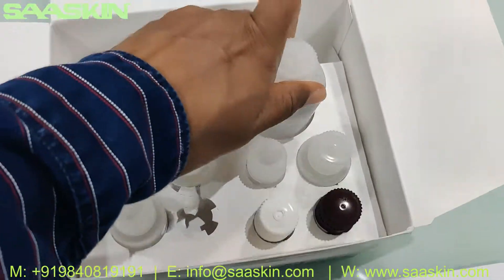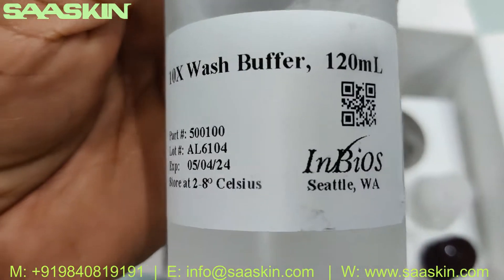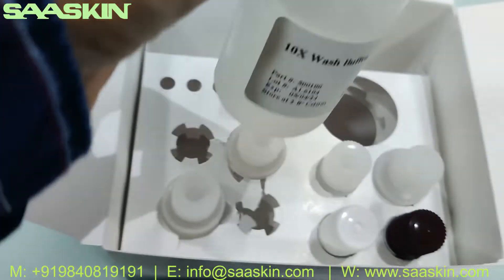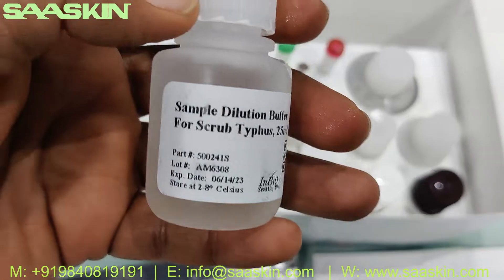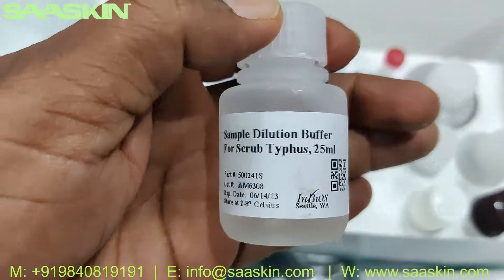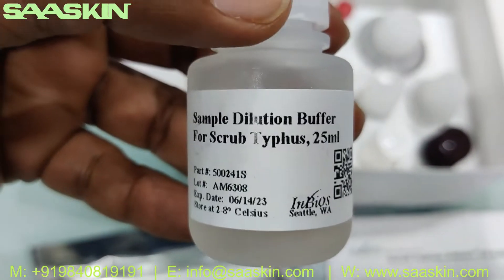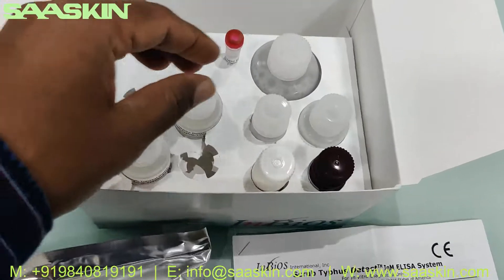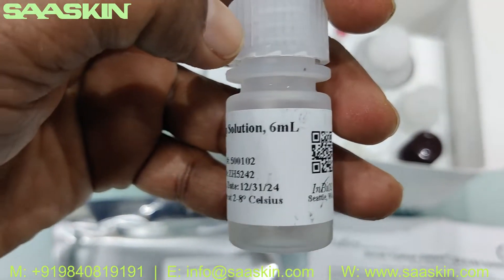This is the 10x Wash Buffer, 120 mL. All of these have to be stored between 2 to 8 degrees Celsius. Then we have the Sample Dilution Buffer, 25 mL — there are two bottles of this, each 25 mL. This is the Stop Solution, 6 mL.